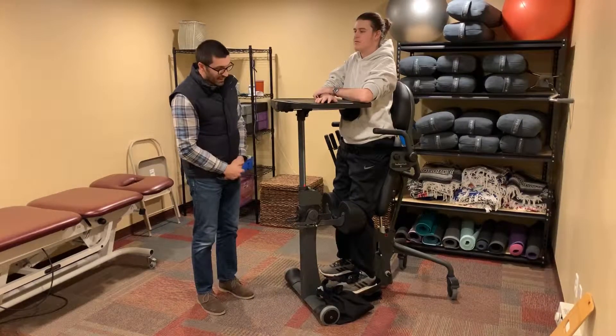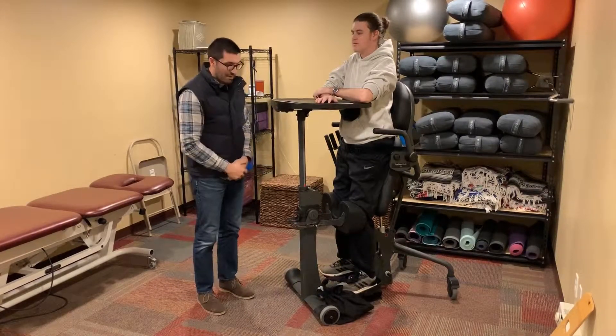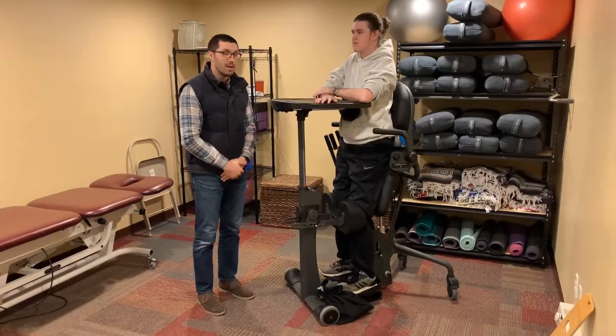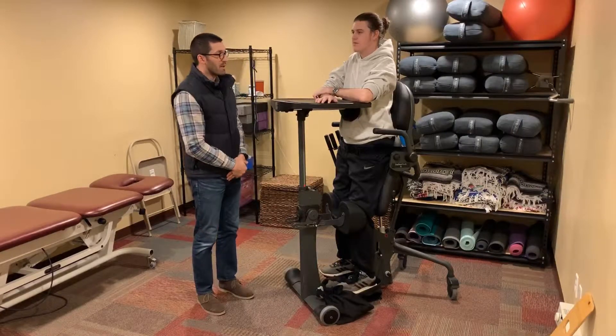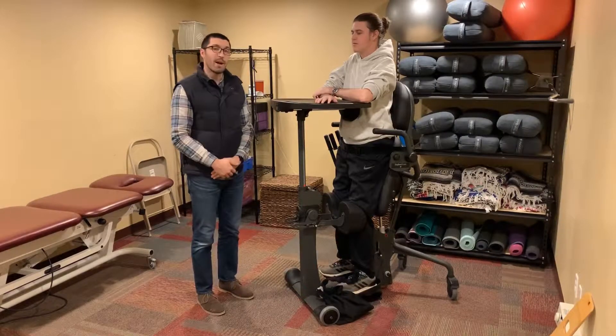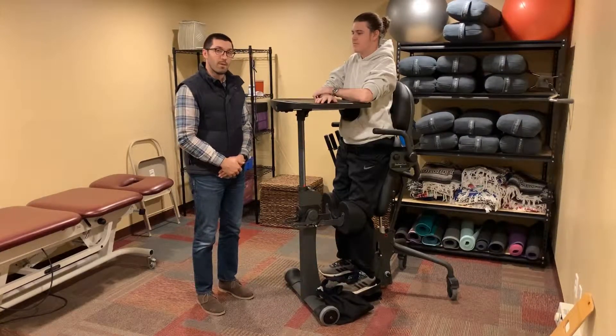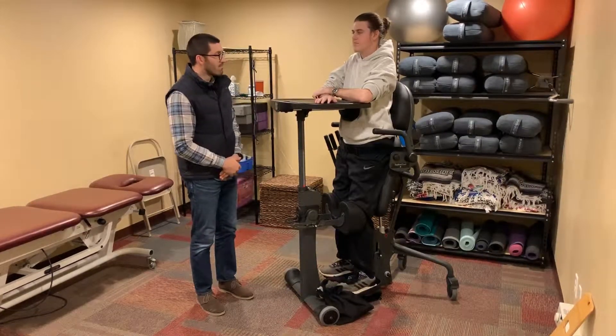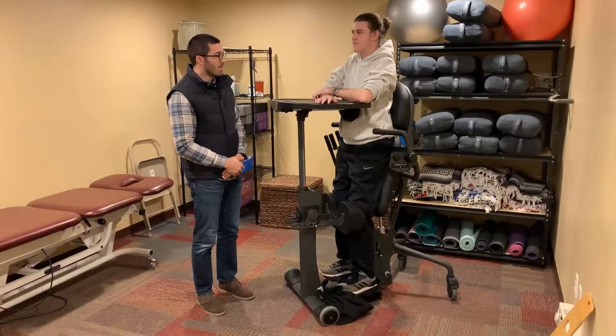One last thing in Trev's case: we make sure that the catheter is down below his feet so things are draining appropriately. You're not going to run into that with everyone, but in his case we do.